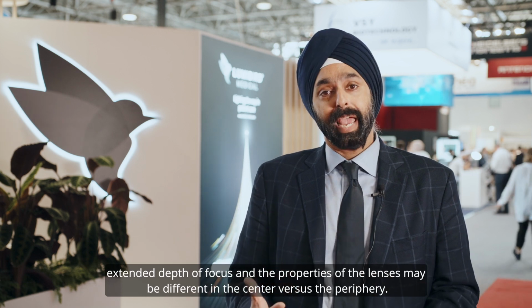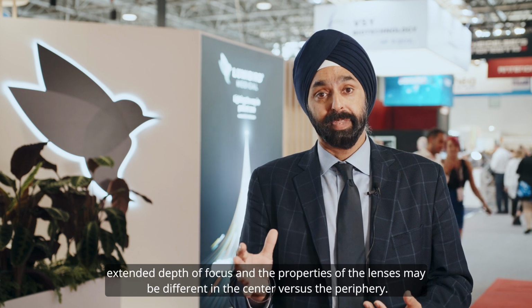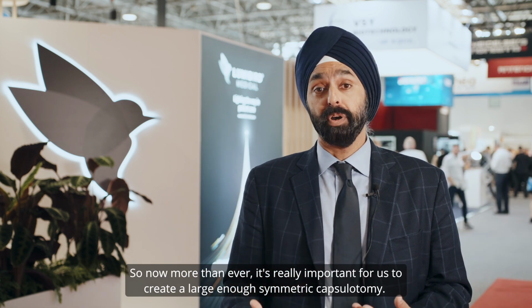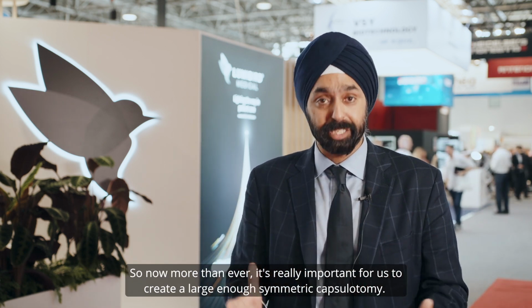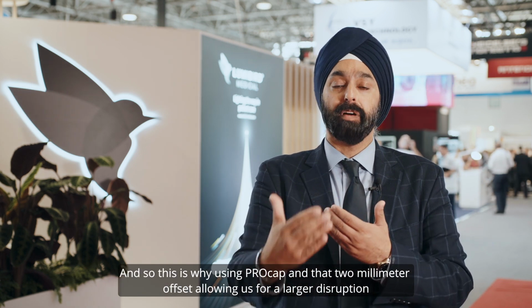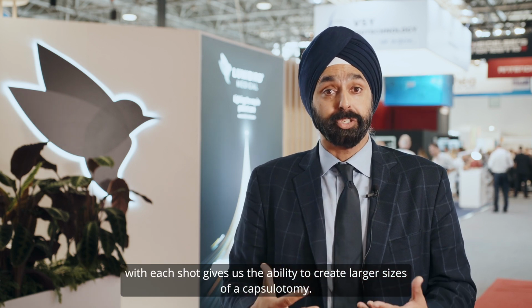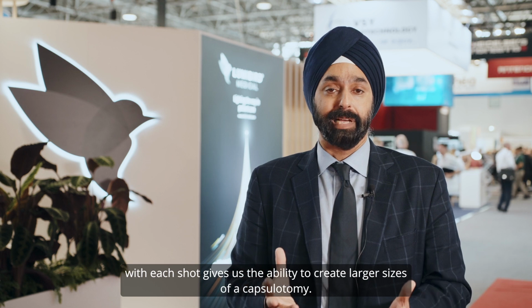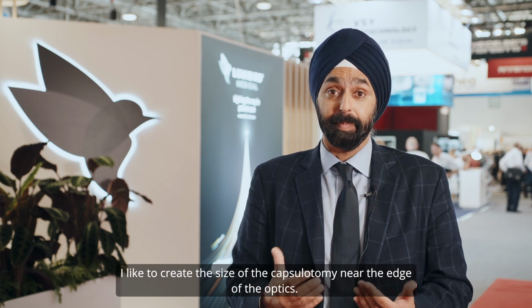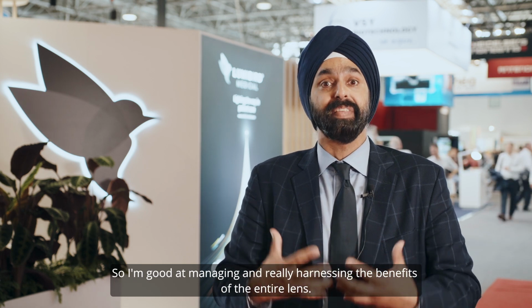I think we're now in the age of premium IOLs, multifocality, extended depth of focus. And the properties of the lenses may be different in the center versus the periphery. So now more than ever, it's really important for us to create a large enough symmetric capsulotomy. And so this is why using PROcap and that 2 millimeter offset, allowing us for a larger disruption with each shot, gives us the ability to create larger sizes of the capsulotomy. I like to create the size of the capsulotomy near the edge of the optic, so I'm managing and really harnessing the benefits of the entire lens.